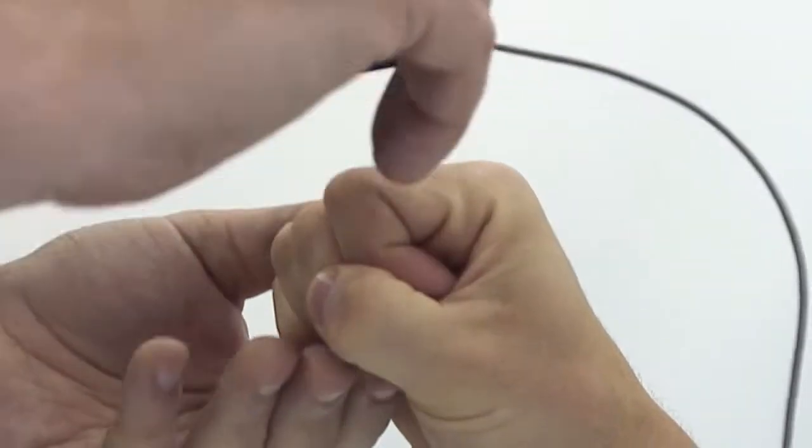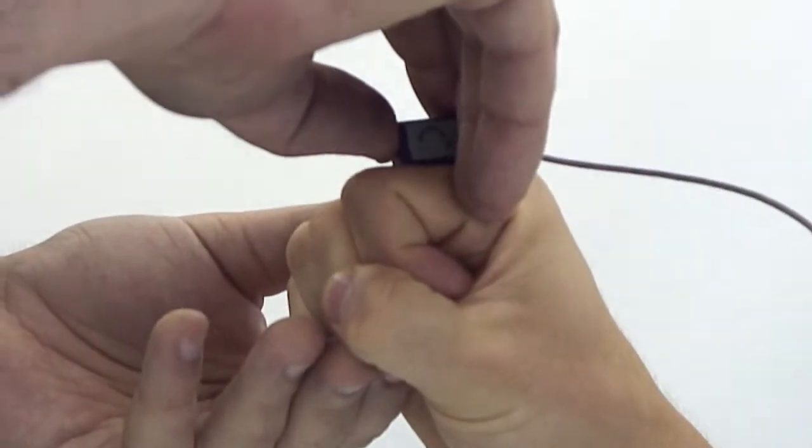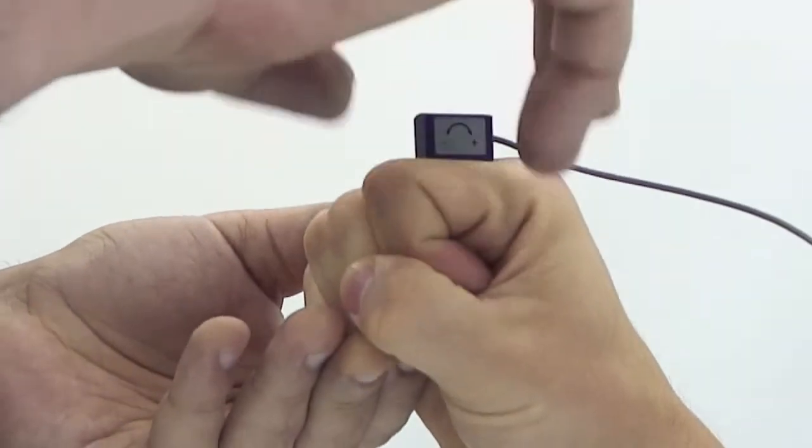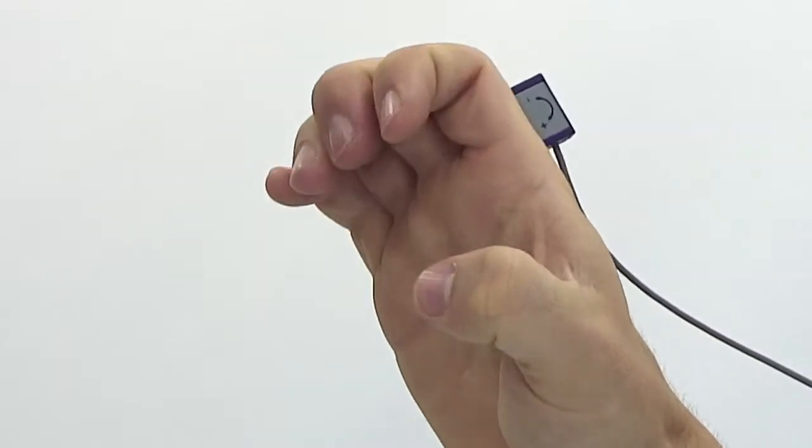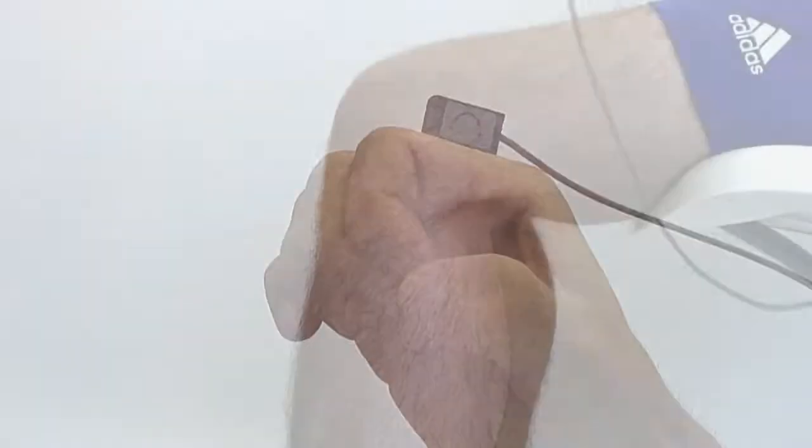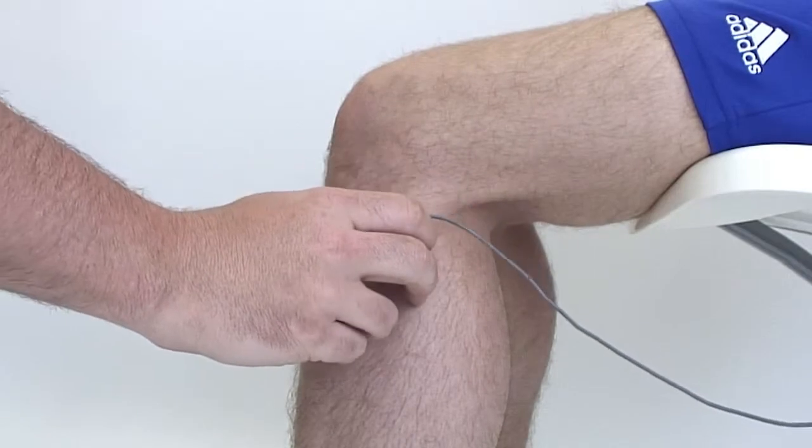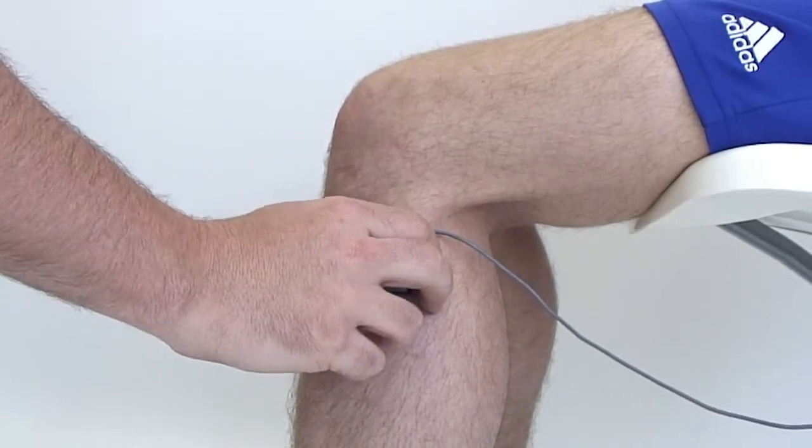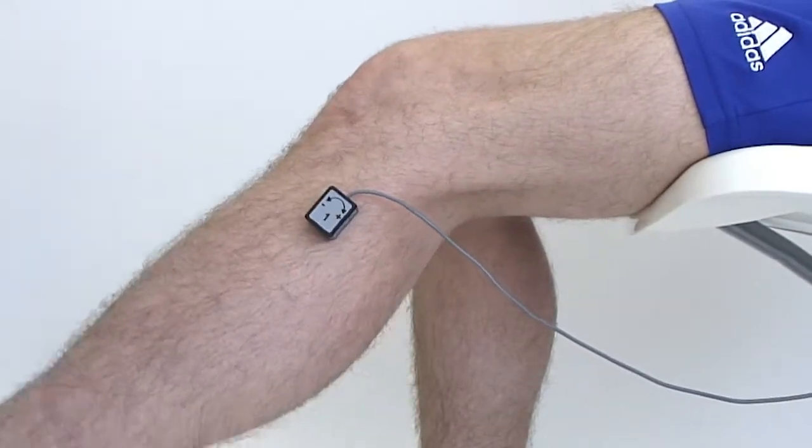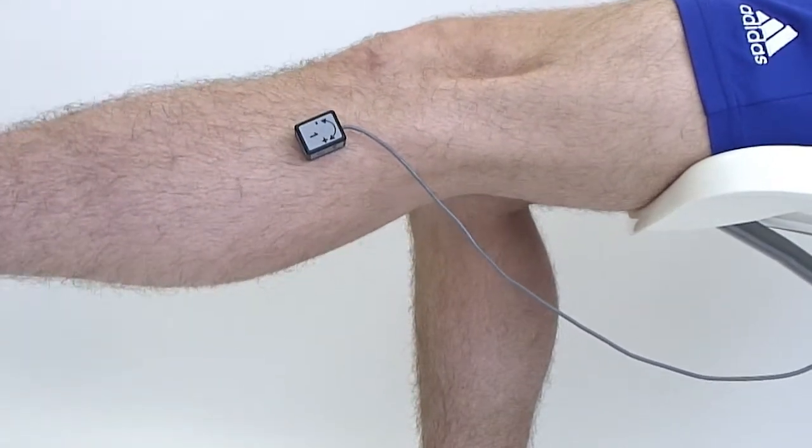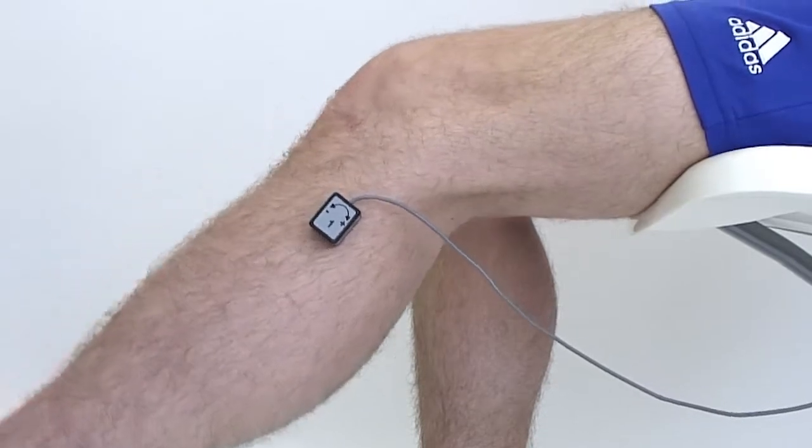Where there is some joint movement but not yet sufficient strength to grasp or move other devices, AngleX is the perfect rehabilitation tool. The sensors are simply attached close to the joint to be exercised.